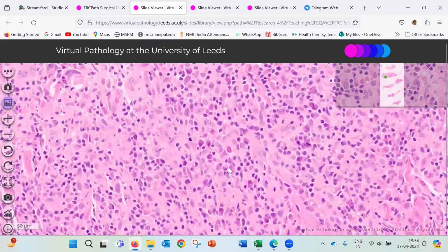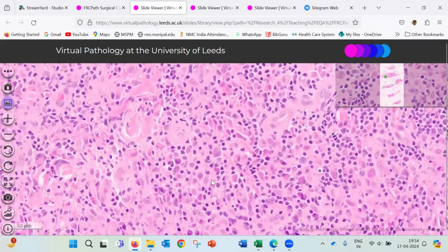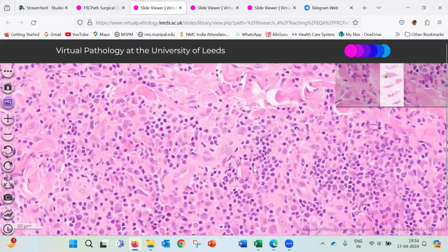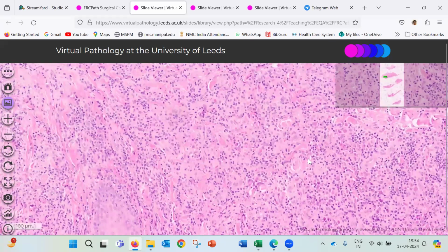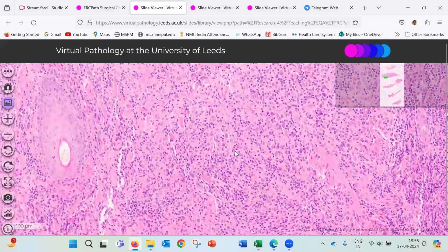My close differential will be histoplasma. Look, there are a few dot-like organisms. So my differential will be histoplasma, but the histoplasma will be negative for Giemsa, which is positive in Leishmania, and the silver stain will be positive in histoplasma, whereas silver stain will be negative in case of Leishmania. And you can suggest some microbiological correlation, number one. Number two, that antigenic ELISA test is confirmatory, and the gold standard confirmatory test is DNA PCR for this case.